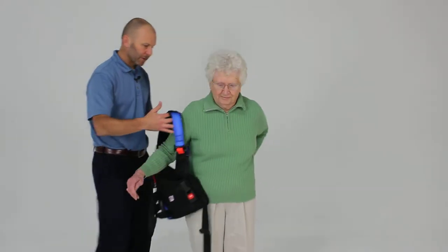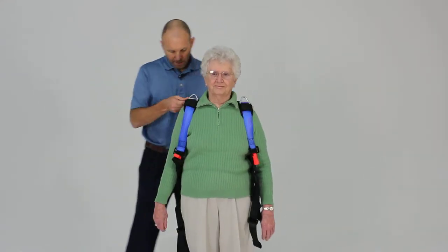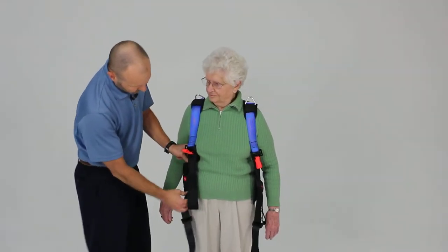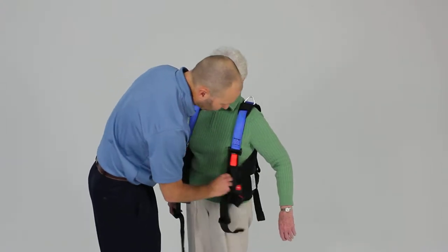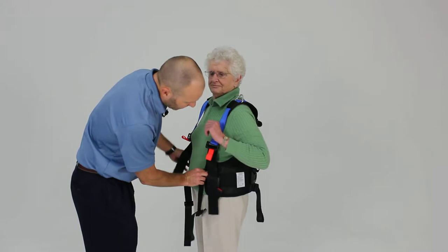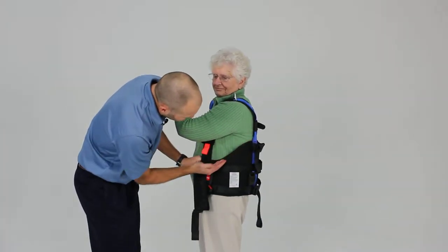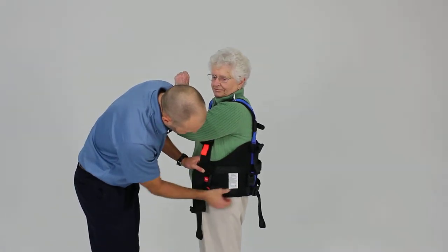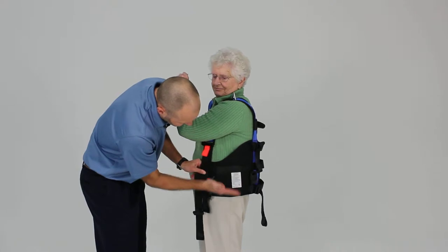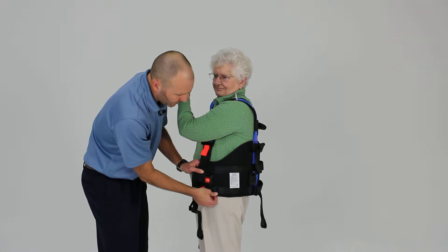We're just going to place the top portion just like a vest on the patient. We want to adjust the length of the shoulder straps here to allow the waist belt to be in the appropriate position. We're looking for this to be positioned so that it comes around under the angle of the ribs and the lower portion of the belt is just over the top of the iliac crest — kind of between the iliac crest and the greater trochanter — so we get a good anchor on the pelvis.